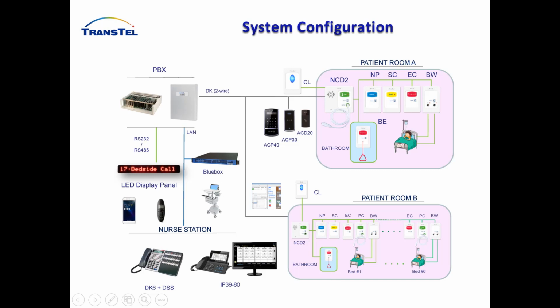So after the nurse car reaches our blue box, or the PC on the nurse station reaches our blue box, the blue box can send the information to the little PC to notify that some patient has made a nurse call. Here, in the nurse station, the PC can also show on the monitor which room made the nurse call and what kind of nurse call is being made.